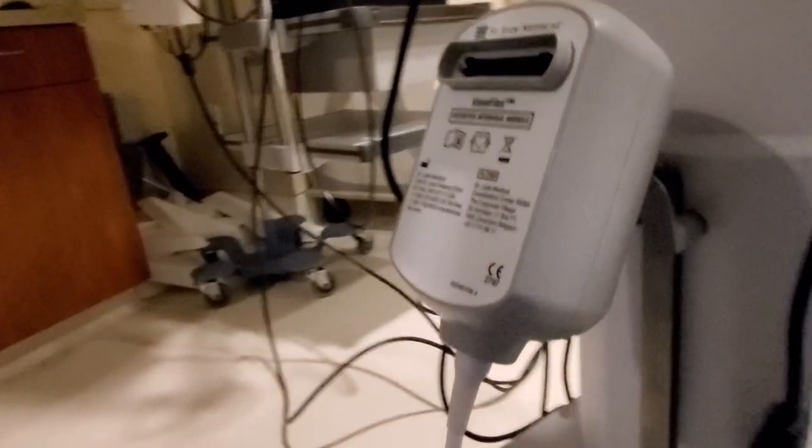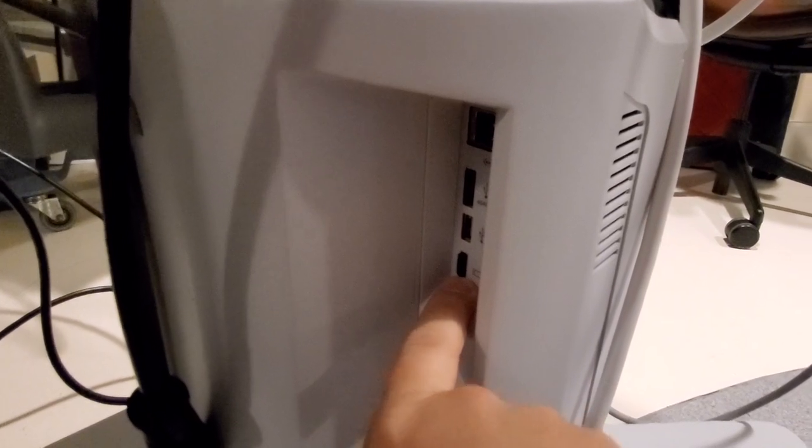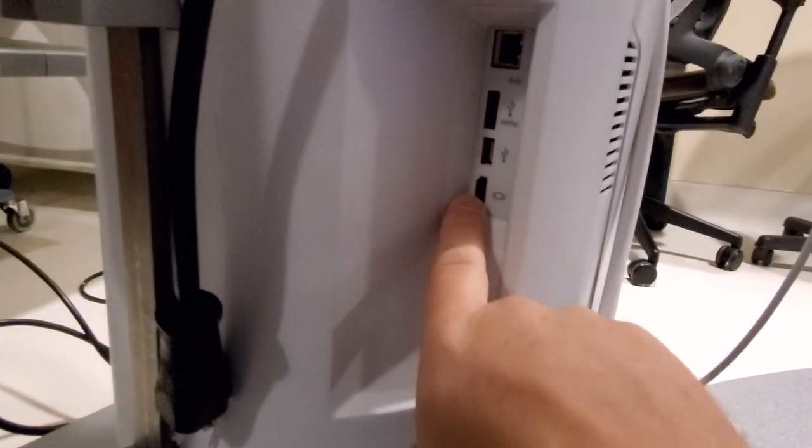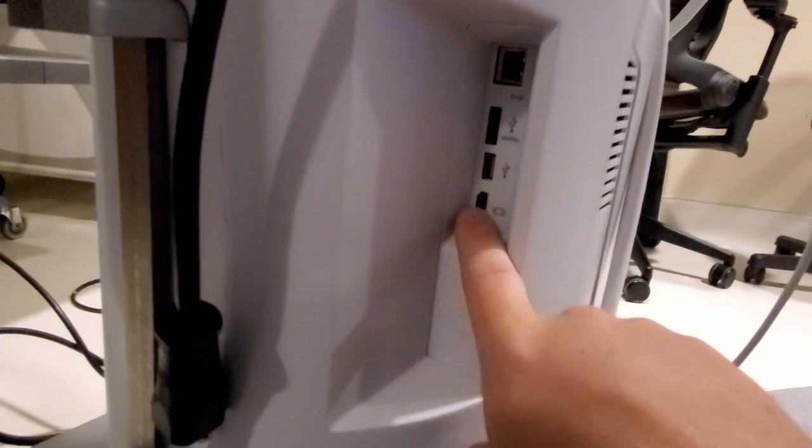Now, one of the things I wanna talk to you guys about, let's see if this guy has it. Okay, so they start getting smart. You can see here that it's got a HDMI out. Well, one of the things that I always want to stress is we never want the users plugging and unplugging items straight to the piece of equipment itself.